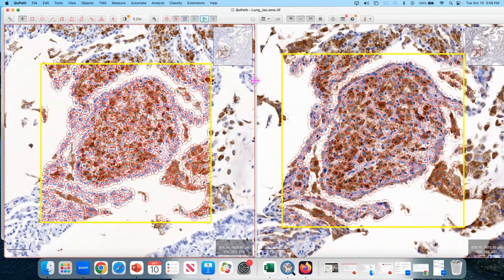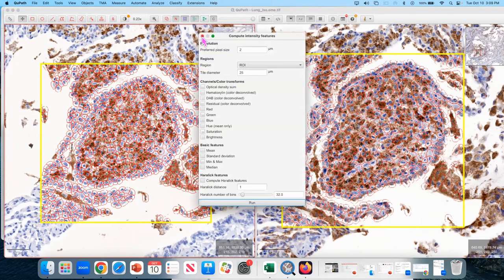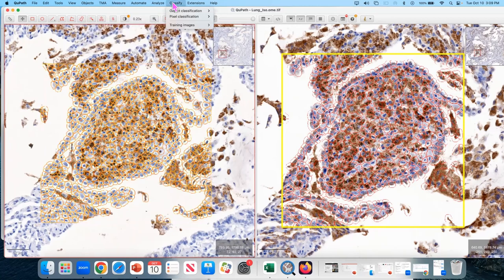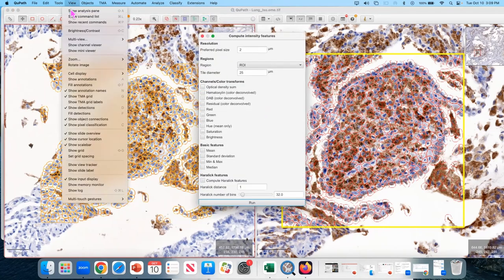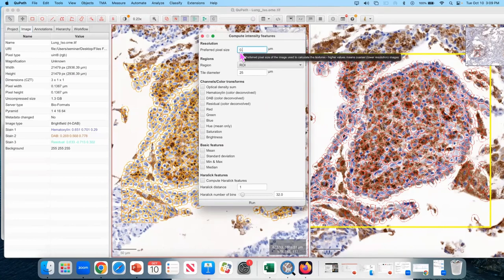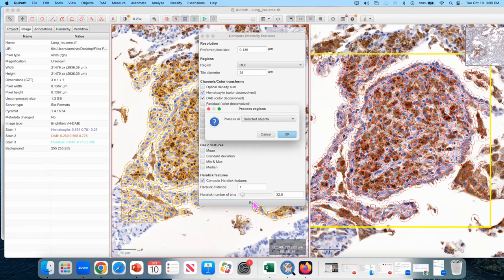We have a pretty decent result, to be honest with you. And we're gonna add intensity features. To do that, I'm gonna select all cells. And it would be good to know what is the pixel size in this image. It's 0.136. I want the hematoxylin and I want those Haralick features. Sorry, DAB as well. Yeah, let's take both. The DAB is actually the more important here. It's run.